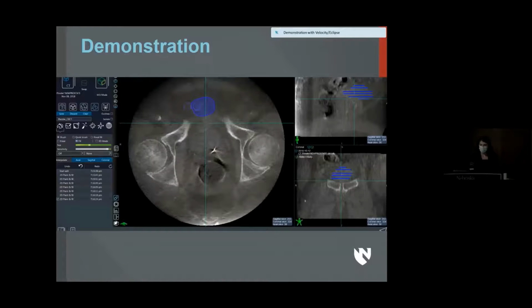So once we have our contour completed, we can interpolate and then feed that into the algorithm. So this tells you why it's important that your process has contouring tools so that you can do something like this and mitigate the problems that we might have with the algorithm.